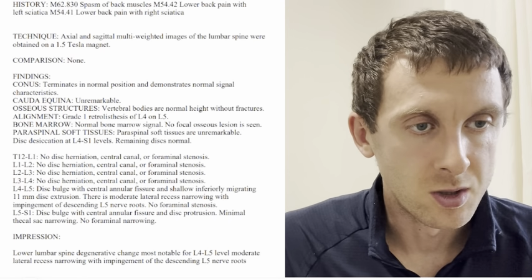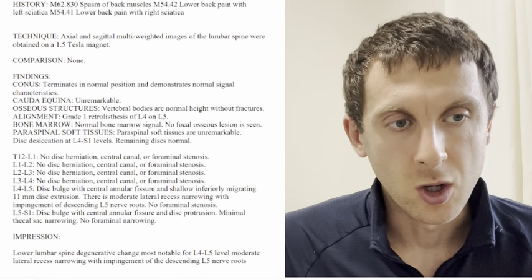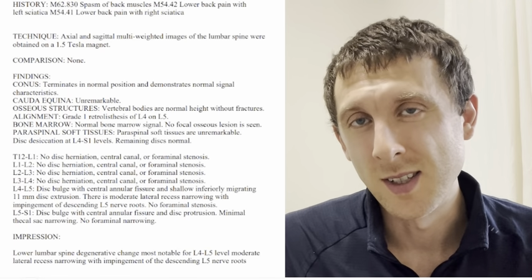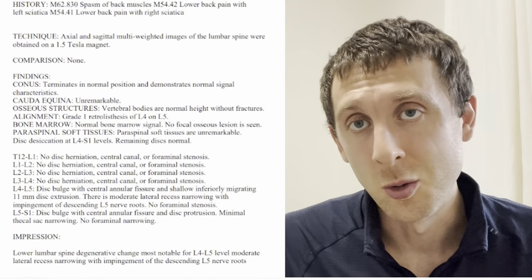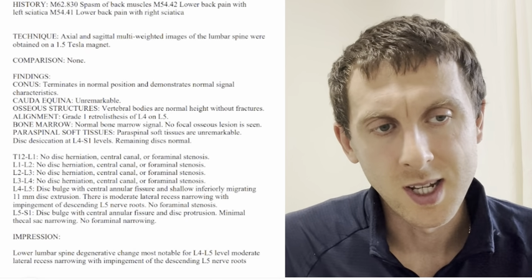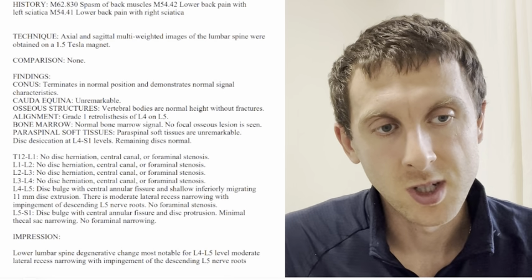And then findings. So basically the layout of the MRI is under the findings, they comment on all of the spine and the characteristics of the spine. Sometimes they just put it as one blanket statement, just with regards to making sure everything else is ruled out: tumor, cancer, infection, any sort of lesions. But sometimes they break it down. So in this case, they actually broke it down into each individual segment or structure that they're looking at.